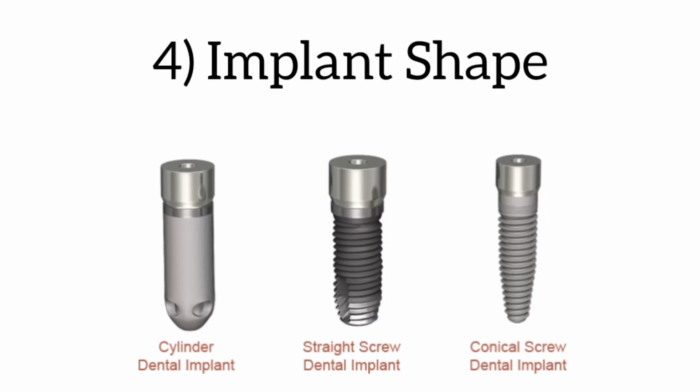Self-tapping implants have a cutting tip and cut their threads into the drill hole as they are screwed in. Non-self-tapping types are non-cutting and need a tap to cut threads into the pre-drilled hole in the bone. The best configuration with adequate bone available is a cylindrical self-tapping implant.